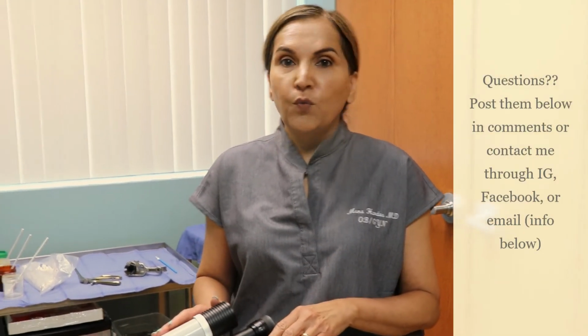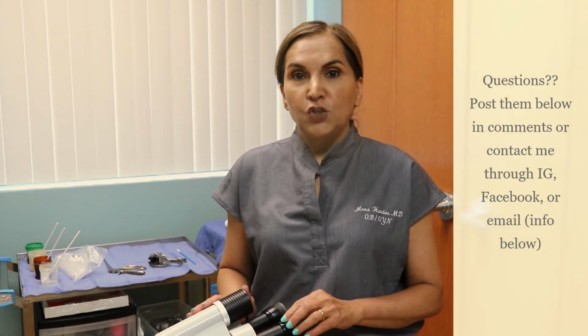It's going to show me how much of your cervix is involved, so how extensive that abnormality is. And when I take a biopsy, it's going to tell me what is the grade of the abnormality, so we can plan treatment. So it is very important. So don't worry about a colposcopy. If you have an abnormal pap smear, make sure you get one.